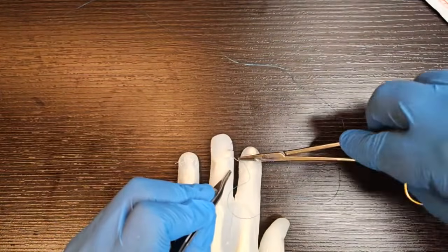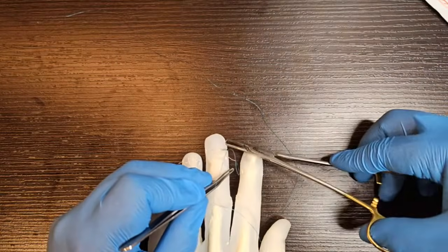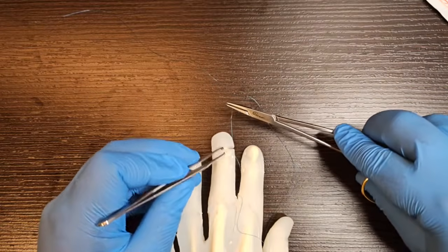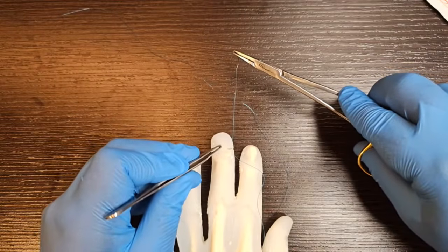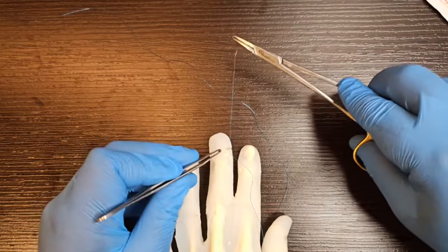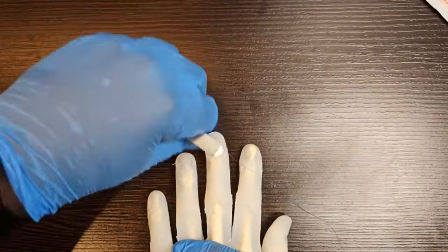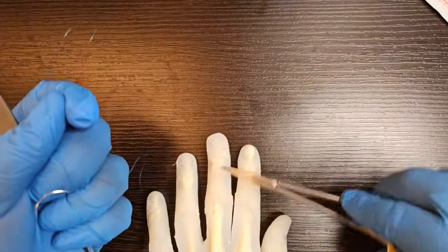If you suture from shore to island, it's already happening now. When you pull the suture, you see how it pulls the fingertip off? If you haven't got any stabilization, or the bit that is fixed is fragile, you will literally just pull the fingertip off or pull the graft off. So we don't do this. We don't do this because this is bad practice. So what we do is stitch from island to shore.